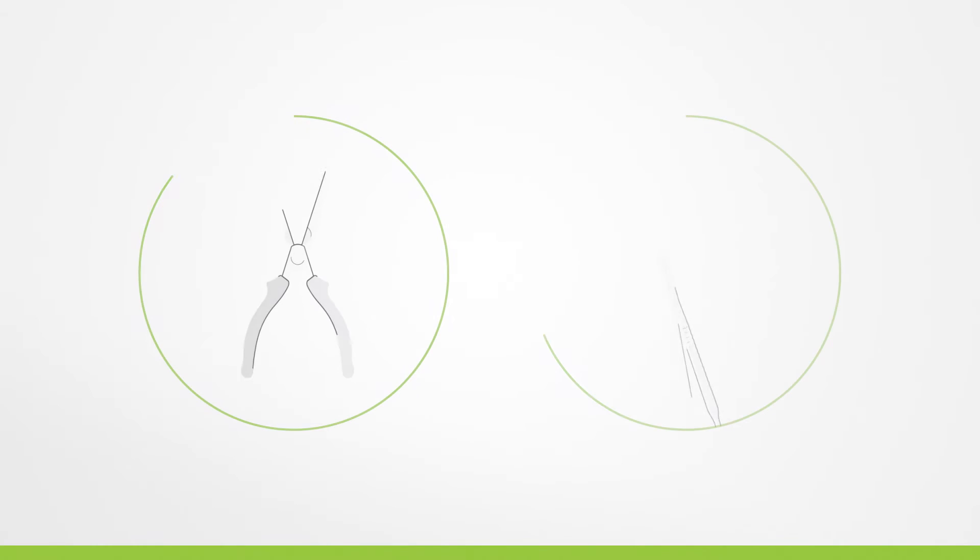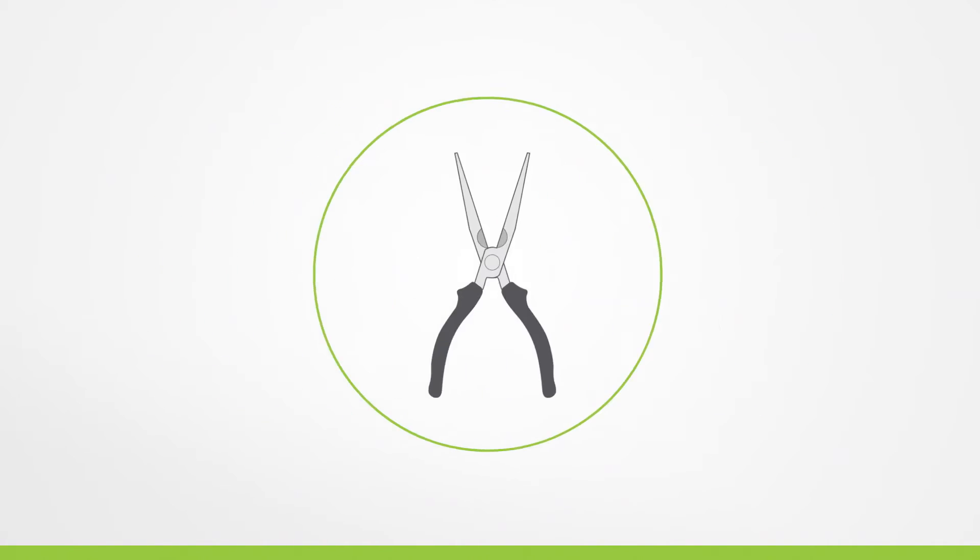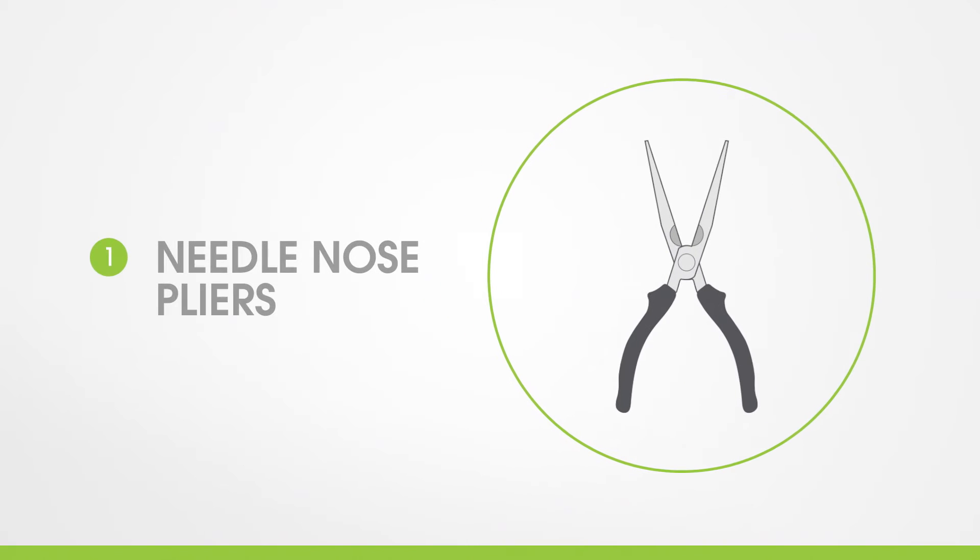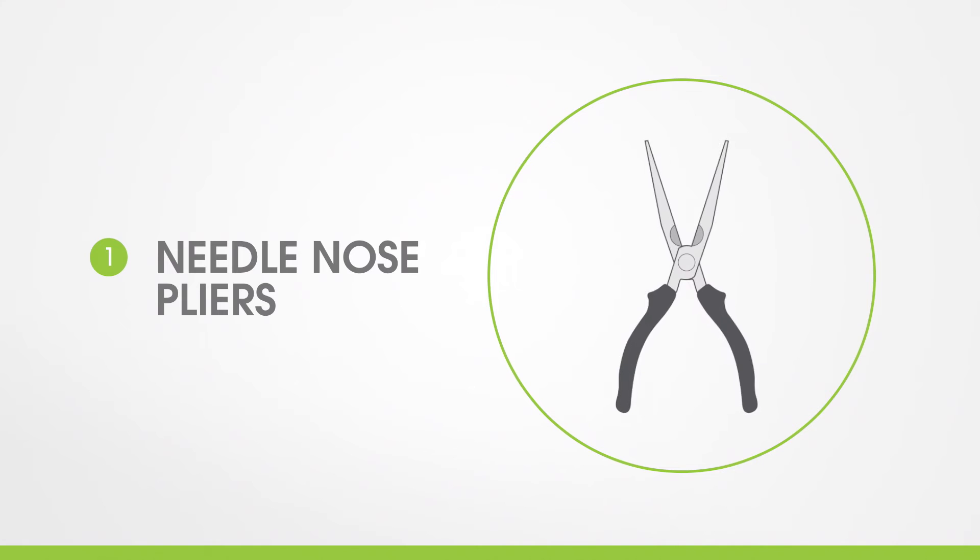Before we begin, you will need a few tools. First, a pair of needle nose pliers or a tool that will give you the ability to grip the battery pin.